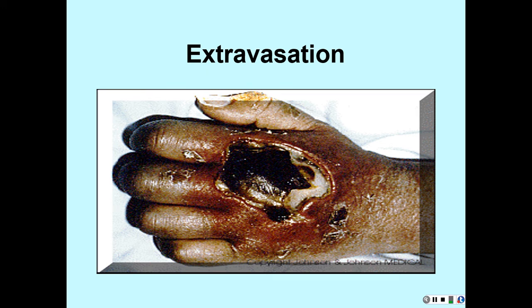You just hook your syringe up to your IV and pull it back. So something like this, usually to get to this, you have the infiltration. The site will usually blister. You'll have a blister there. The tissue sloughs off, and then you have the necrosis.